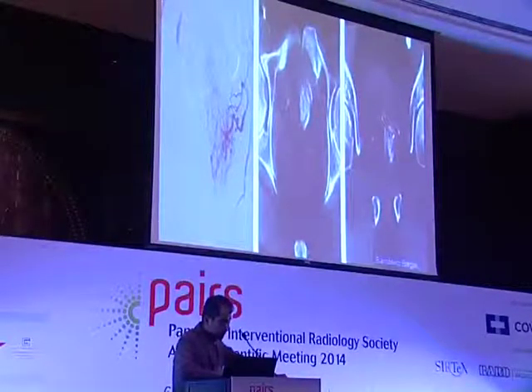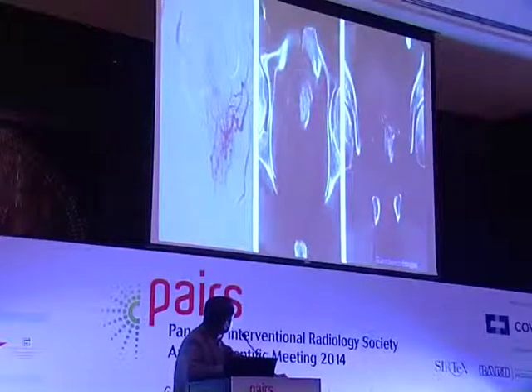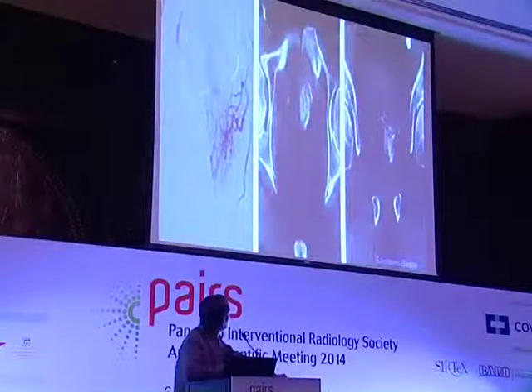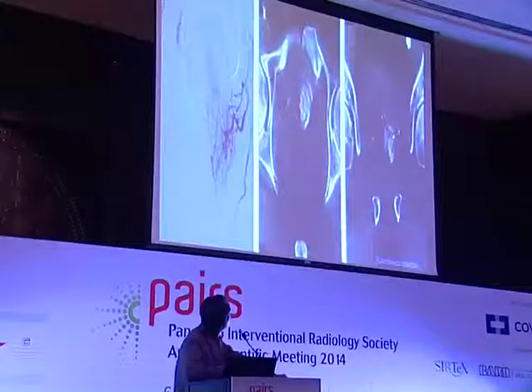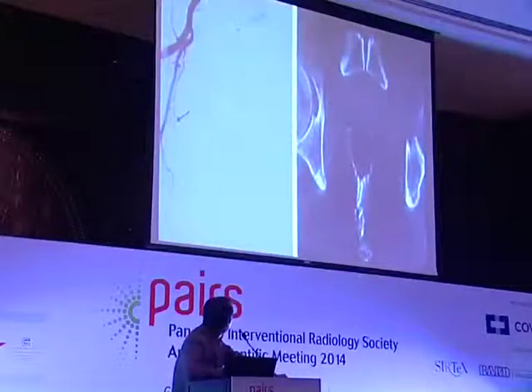This patient was not difficult to superselect the inferior vesical artery and then injection of contrast. If you do a CT angio while the patient is lying down before embolization, this is the image that you want to see, that there is homogeneous uptake of contrast in the half of the prostatic gland in the axial images and the coronal images. At the same time, you have to be careful.